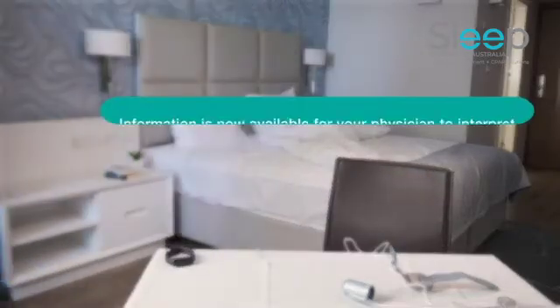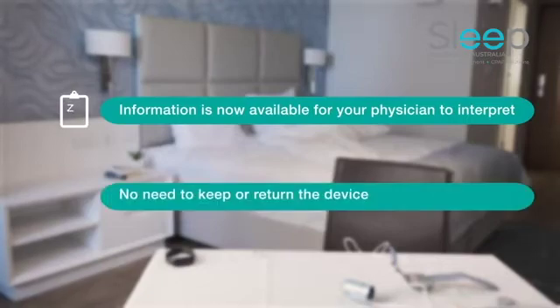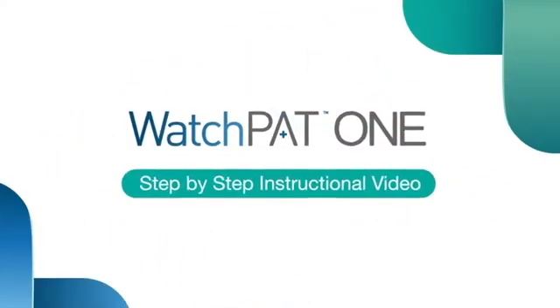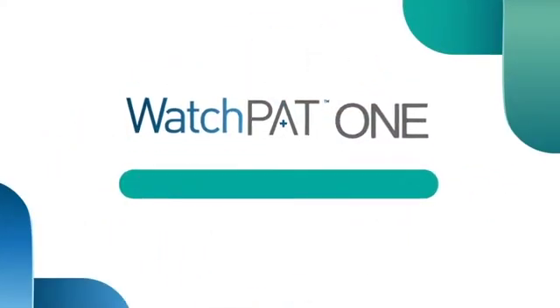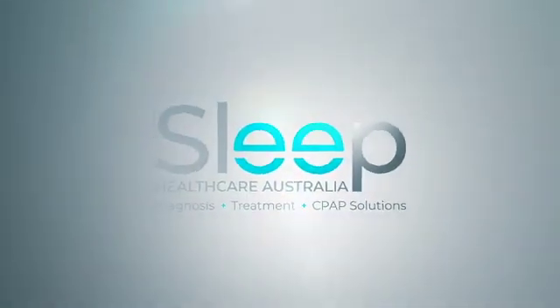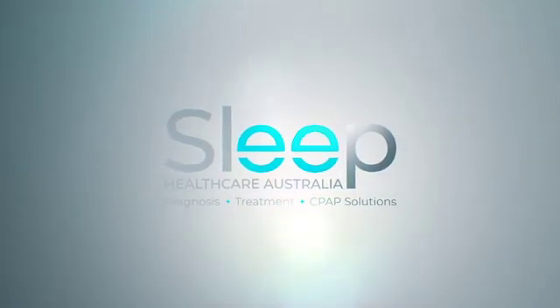The information will shortly be available for your physician to interpret. There is no need to keep or return the device — simply dispose of it. Your test is complete.